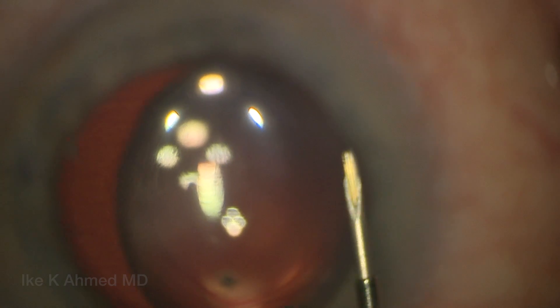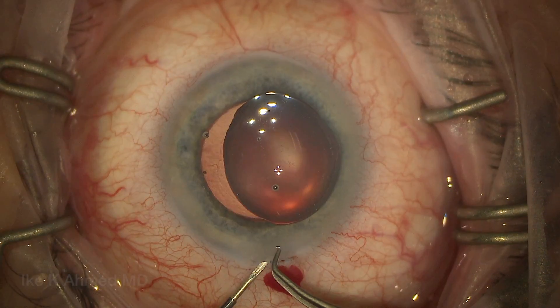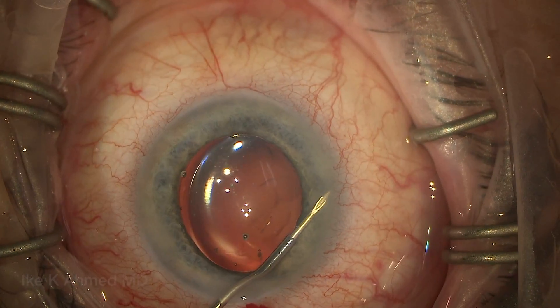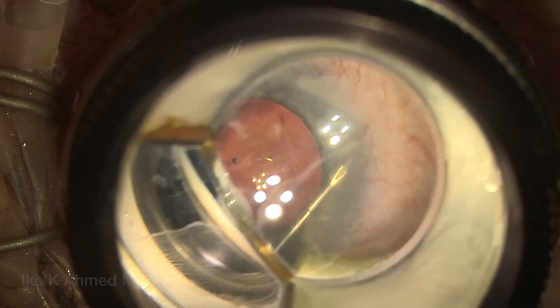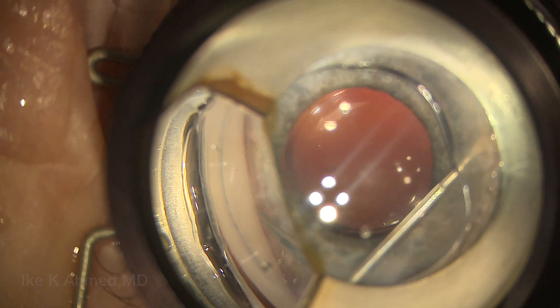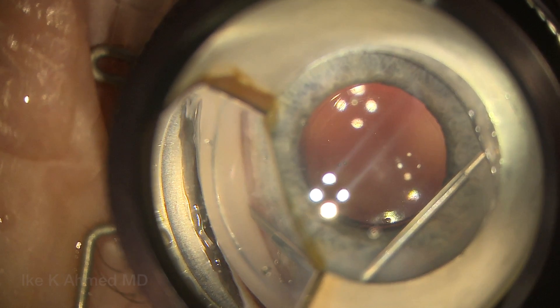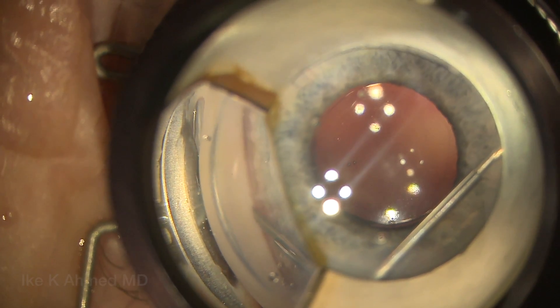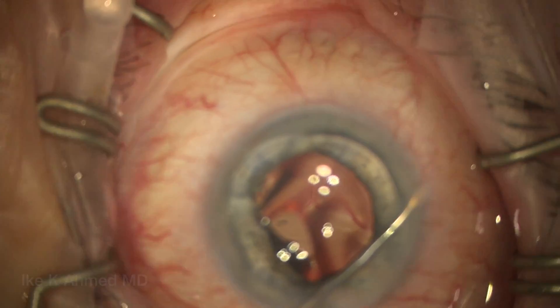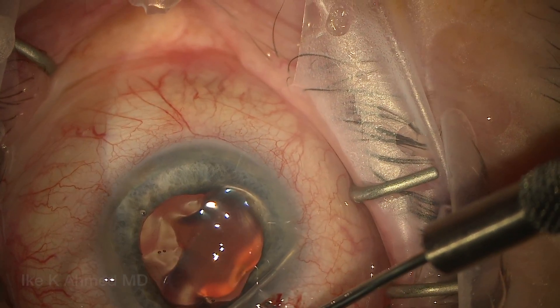Here's the ZEN implant in that 27-gauge needle. We'll pass it through the main incision, lifting up slightly with a pair of forceps. I want to place the needle just toward 12 o'clock, basically entering the angle at the 12 o'clock position aiming to the supranasal quadrant using a gonio mirror. I want to place the needle just anterior to the trabecular meshwork, which avoids reflux bleeding from the canal should we enter it.